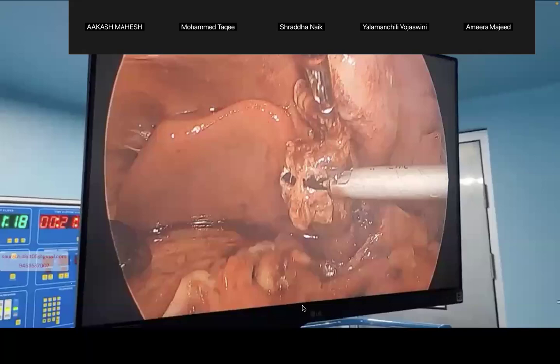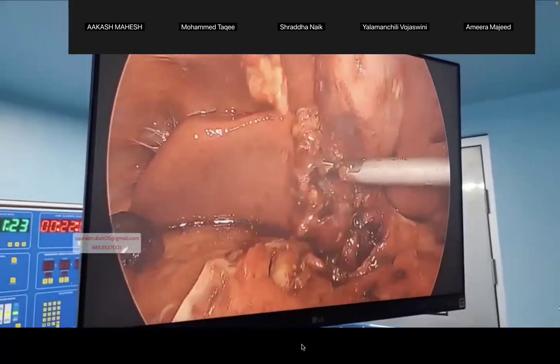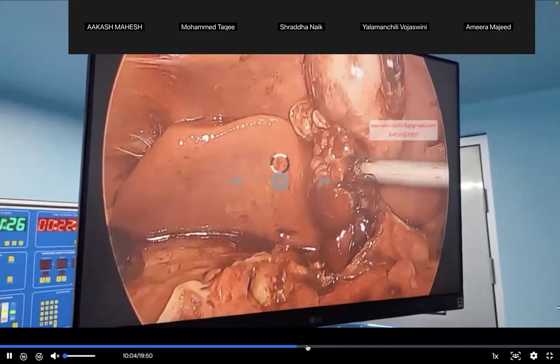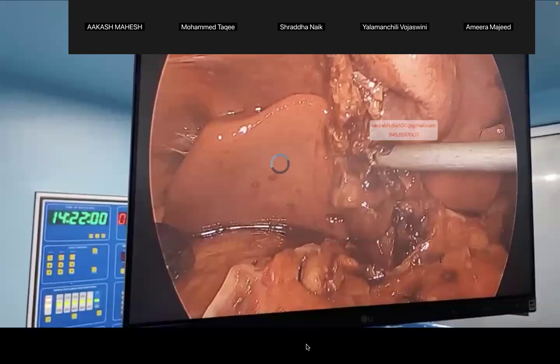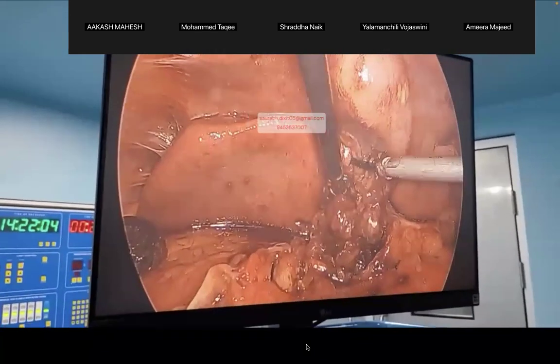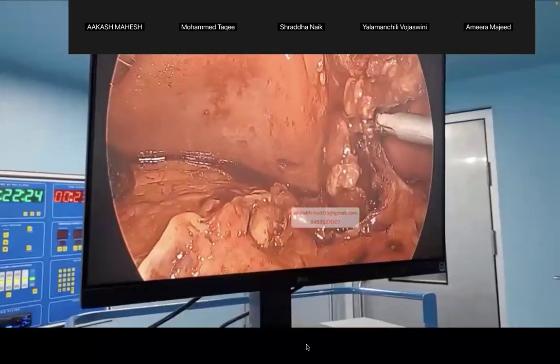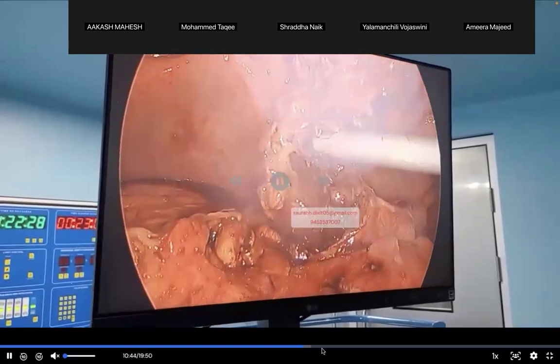Everywhere you are touching, it's actually filthy, fragile, and these are the gallbladders which will destroy your career, because everyone will say, okay, you went for a gallbladder surgery and the doctor killed you, or the patient died, that doctor deserves a treatment under MCOCA and this and that, blah and blah. So this is the very simple thing. Whenever you get a difficult frozen Calot's, do a partial cholecystectomy rather than damaging the CBD.